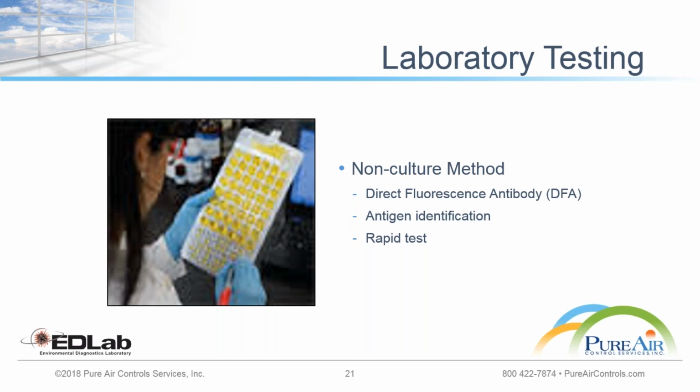Sure. For laboratory testing, there are basically three different kinds of methods used nowadays. The first one is the non-culture method. The non-culture method uses either direct fluorescent antibody, which I will explain a little more, or antigen identification and rapid test methods. A number of vendors sell rapid tests, where you have an antigen-based reaction.